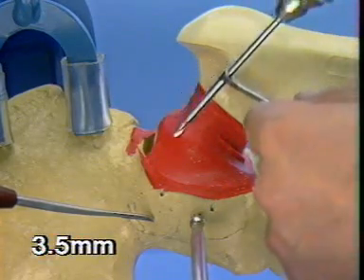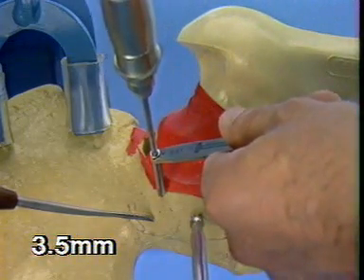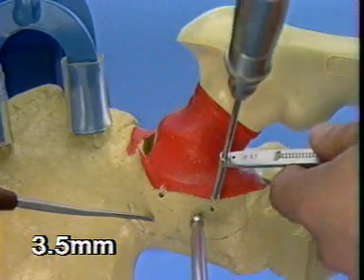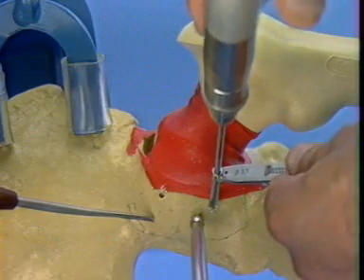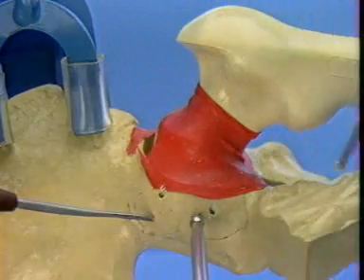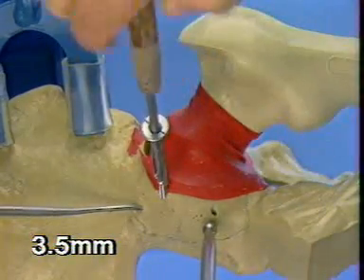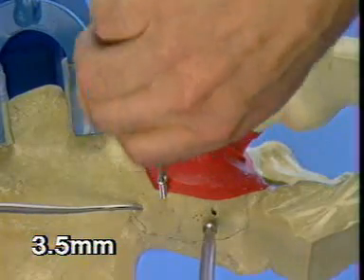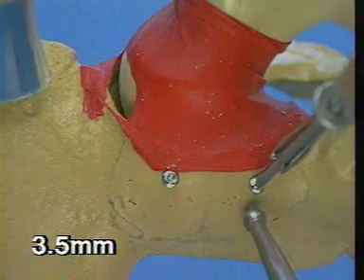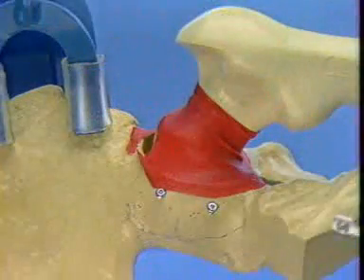Now that we're satisfied with the hole positions, the fragments are over-drilled with the 3.5 millimeter drill bit for placement of the 3.5 millimeter lag screws. Insertion of the corresponding length screws. It's sometimes best not to fully tighten the 3.5 millimeter screws at this point if obliquity of the screw direction to the fracture plane causes a displacement.